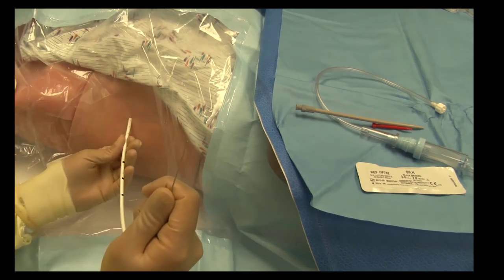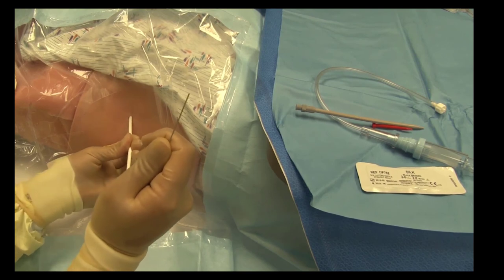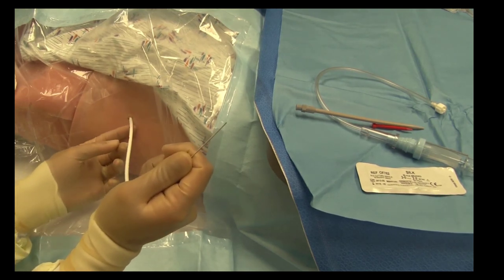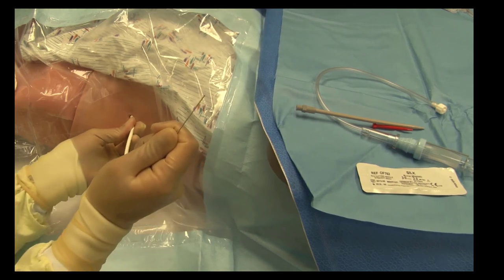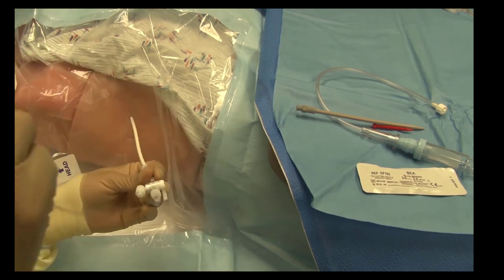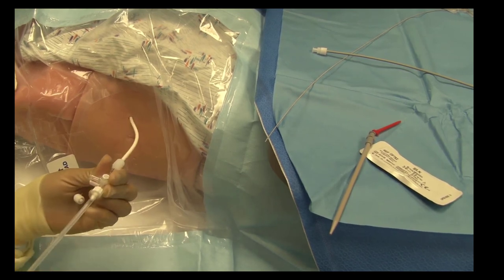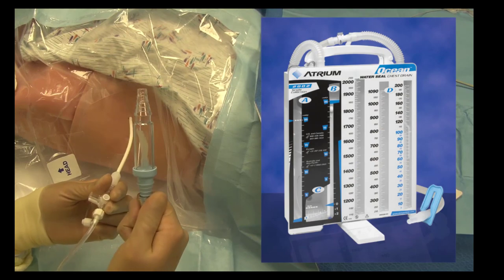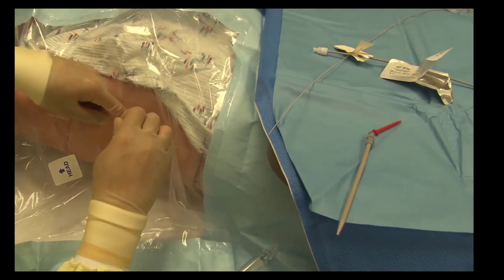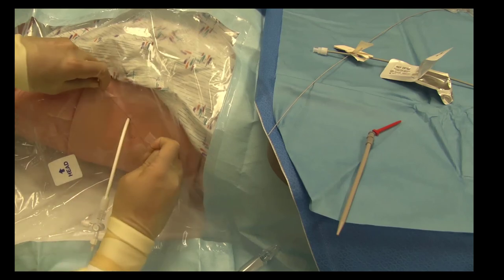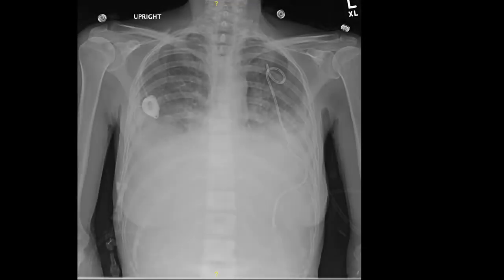Push the catheter, trocar, and wire as a unit until at least the first black line. Then you can advance the catheter the rest of the way while holding the trocar and wire still or removing them at the same time. There is no absolute rule to insertion depth other than you must ensure all the holes in the catheter are well within the pleural space. When the wire is out, attach the flutter valve or connect the tubing to a collection device such as an atrium. Secure the tube with suture at skin with a knot and around the tube using tails before dressing with gauze and tape. Obtain a chest X-ray to ensure good apical placement. Most pneumothoraces from bronchoscopy will not require prolonged chest tube drainage. Once the lung is fully reinflated, the tube can be placed to water seal and a chest X-ray repeated a few hours later to ensure air does not reaccumulate.